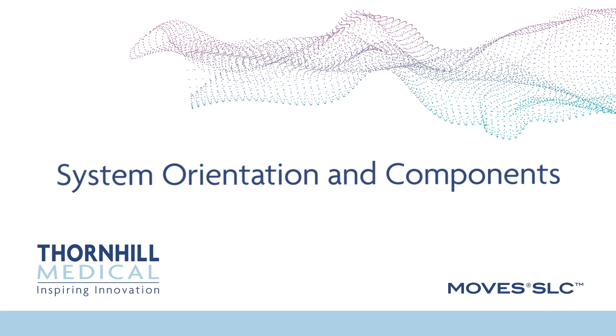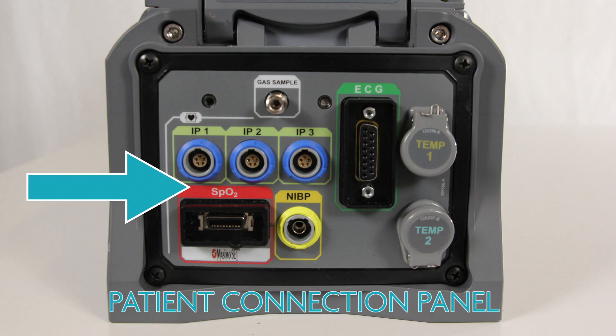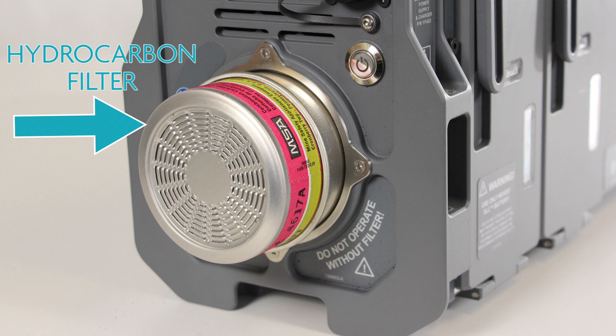System Orientation and Components. Throughout the user manual, there are references to help orient the caregiver with the positioning of the MOVES SLC unit. The front end of the MOVES SLC contains the patient connection panel. The rear end of the MOVES SLC contains the battery compartments, the power connection and control, and the hydrocarbon filter.